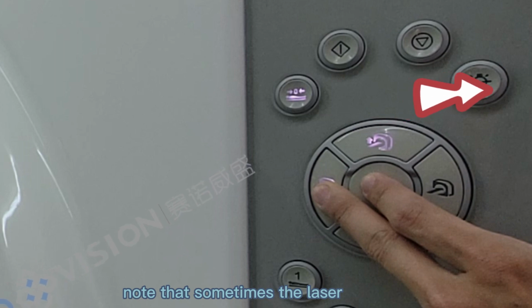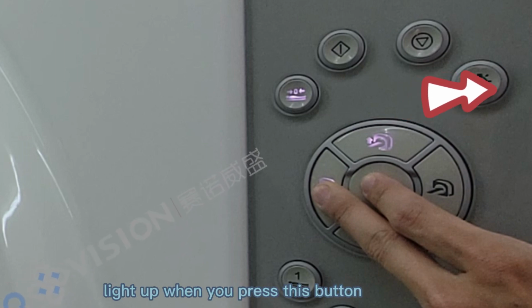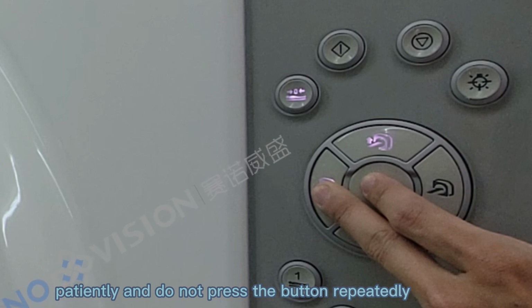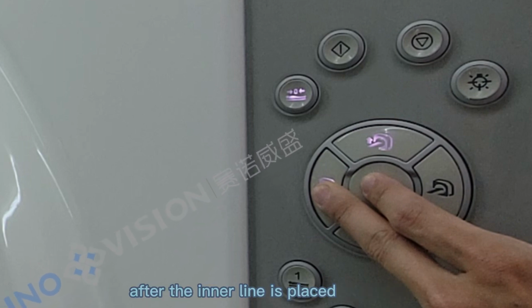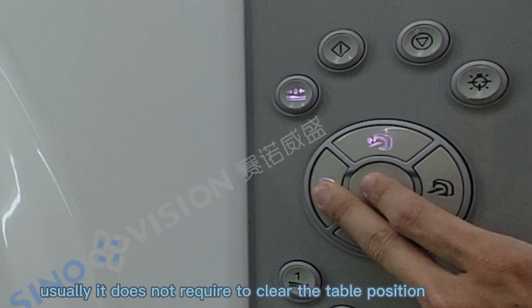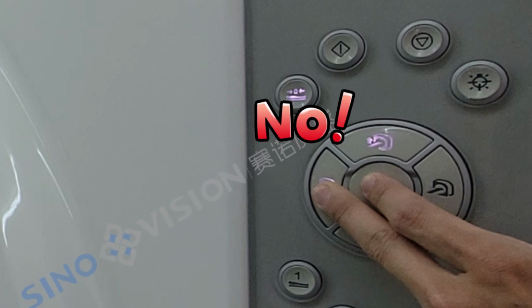Note that sometimes the laser lights may need a few seconds to light up when you press this button. Please wait patiently and do not press the button repeatedly. After the inner line is placed, you can start scanning directly. Usually it does not require to clear the table position.